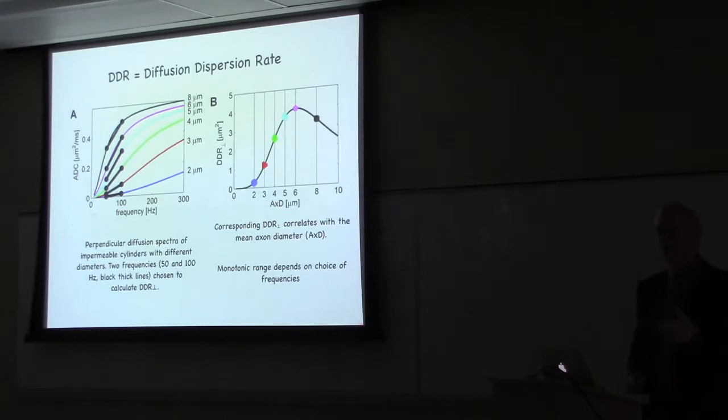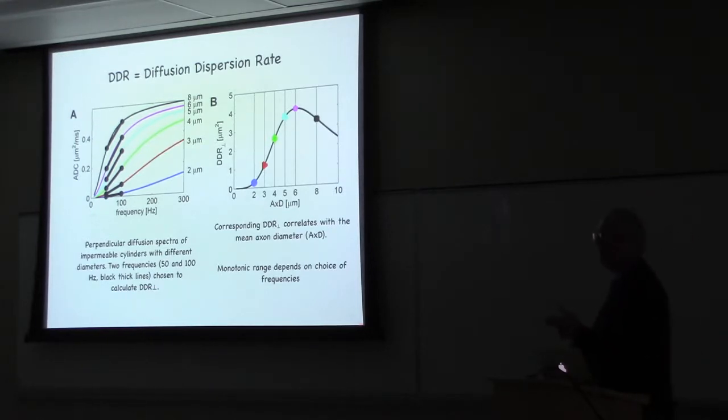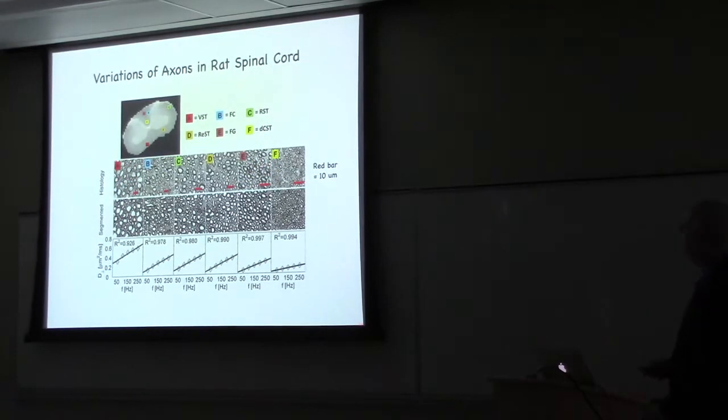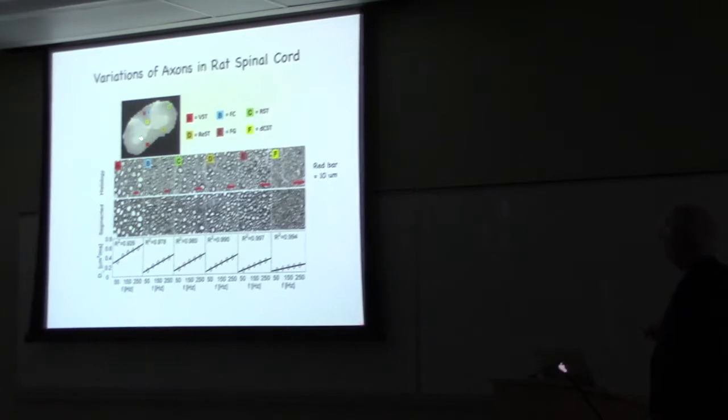restricting structure. And this would actually be a pretty good model for white matter, because white matter is a series of cylinders, essentially all aligned, particularly in places like the spine. So here we have the spinal cord, and these are different regions of interest within the spinal cord. You can see they're labeled here. I forget what these names stand for, but they stand for something technical. And then these are different histological sections. You can see there's a variation in the axonal diameter, according to which of these areas we take.